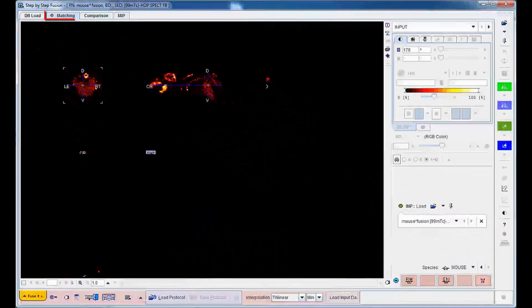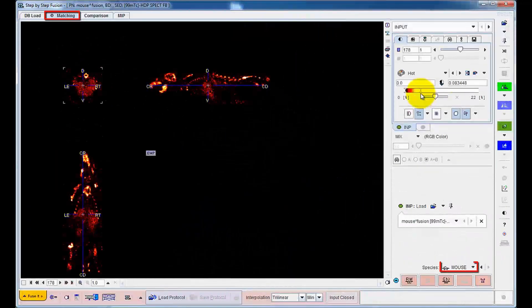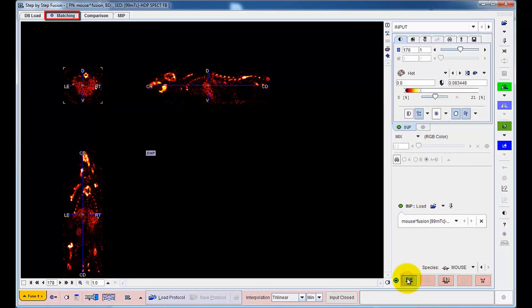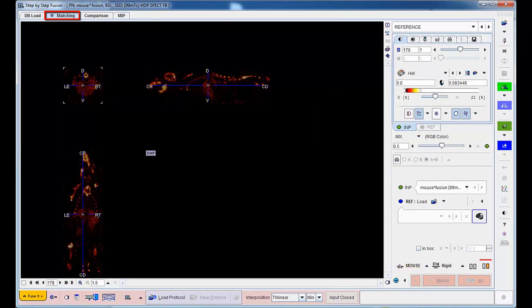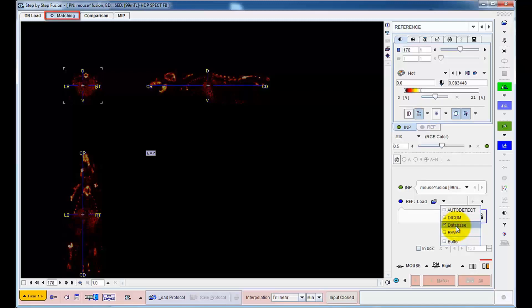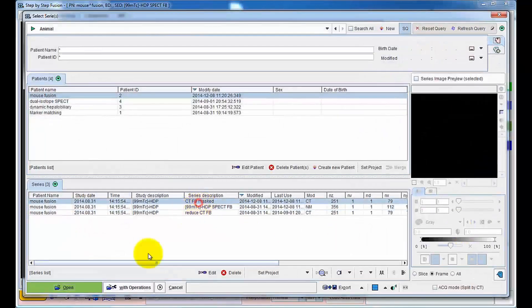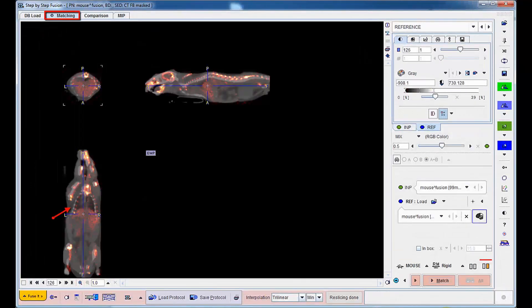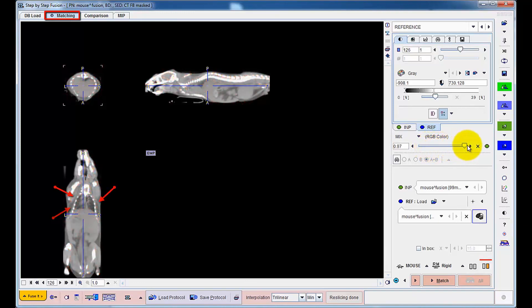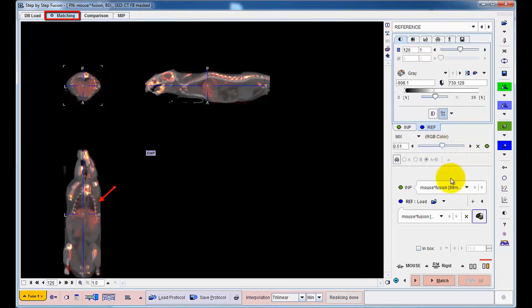The system automatically detects that the data originate from a mouse and applies corresponding presets. After choosing the rigid matching workflow, the CT is loaded. An initial mismatch is obvious in the fused SPECT and CT images, due to differences in coordinate system and reconstructed volume.